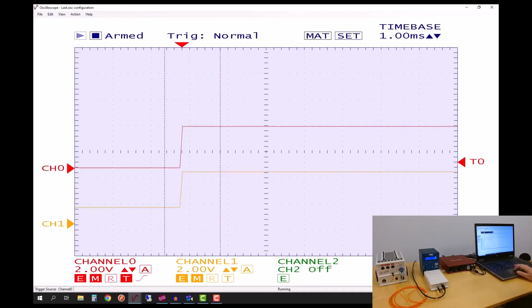I've put in a little fudge factor in order to try to bring the triggers closer in time to the actual sound appearance. There's a delay of about 10 milliseconds in the sound appearing. So I've set some settings in order to try to optimize its sounding, but the best I can do is this jitter in that range of about a millisecond to maybe 2 milliseconds on the serial port trigger.